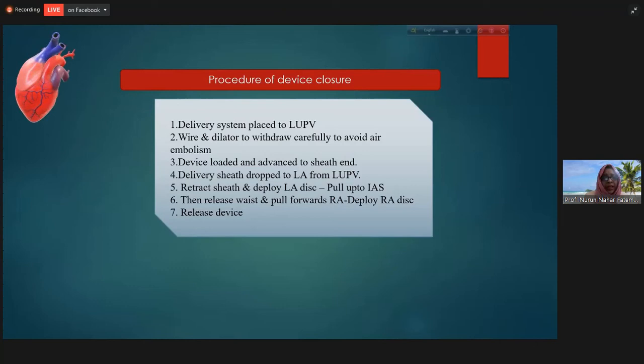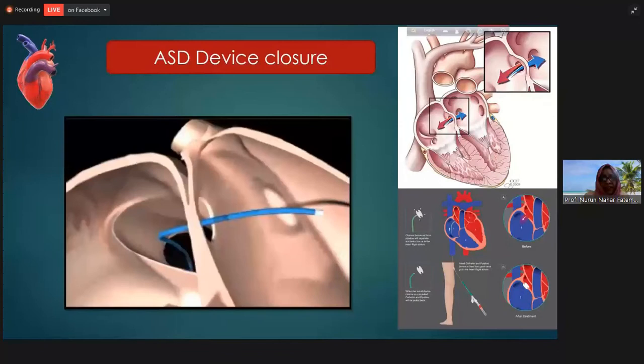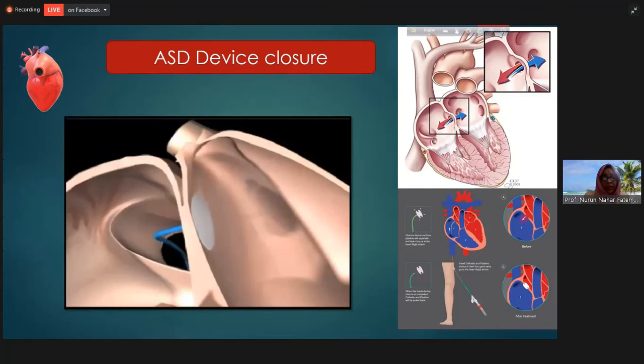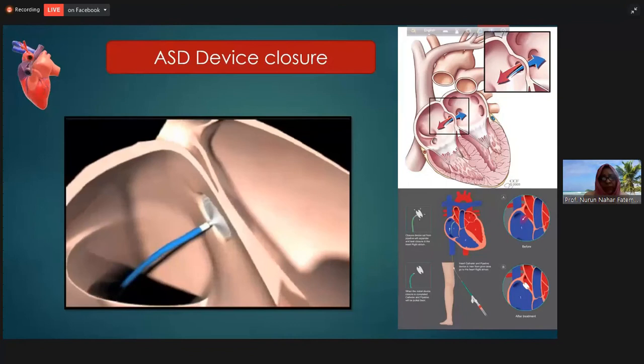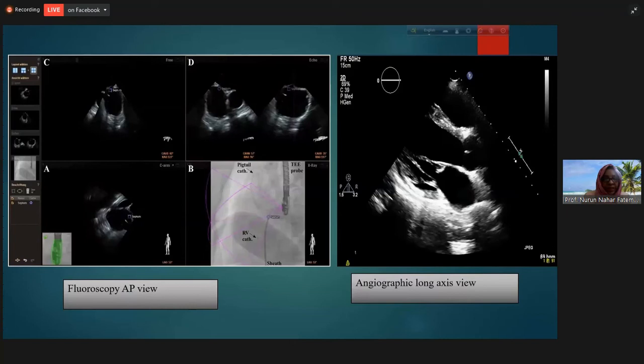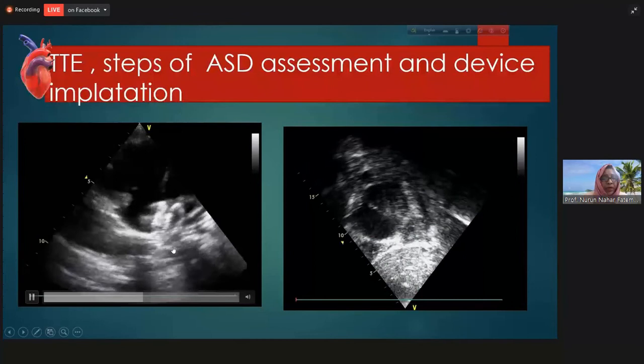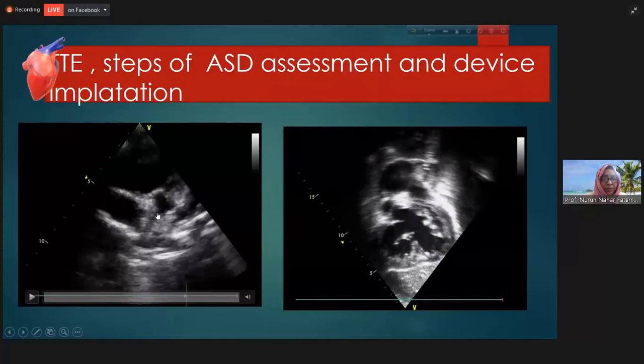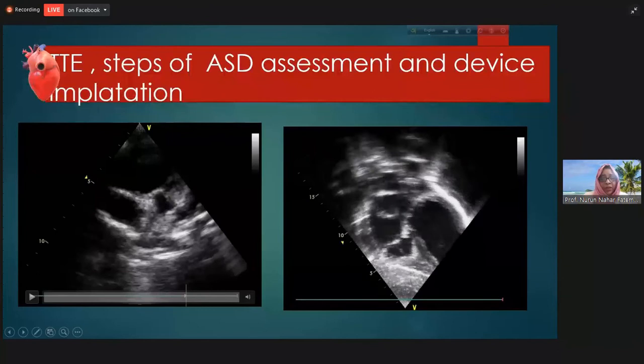In the procedure of device closure, at all steps we take the help of echocardiography — either transthoracic or transesophageal. For children we use transthoracic; for adults, sometimes transesophageal. In most of our cases, we are comfortable with transthoracic. The parasternal short axis view is very important in device closure: if you see the discs of the device on both sides of the aorta in short axis view, the device is in a good position and there will be no risk of embolization.